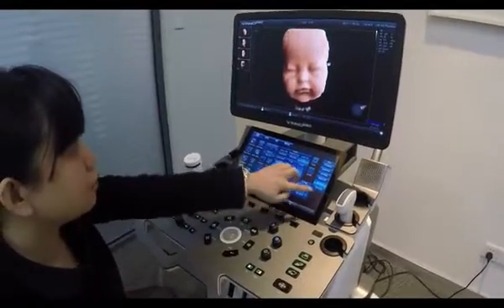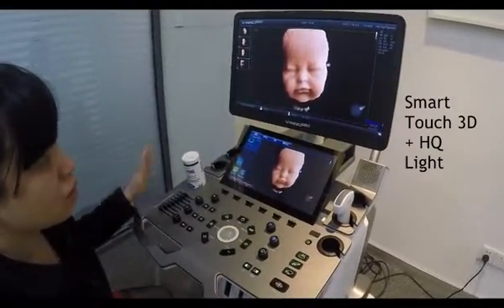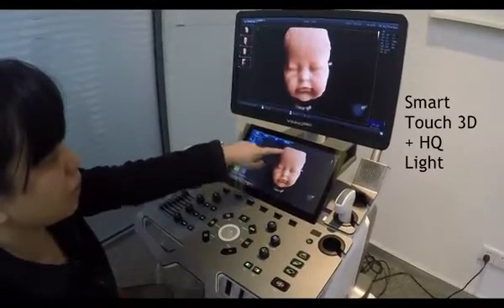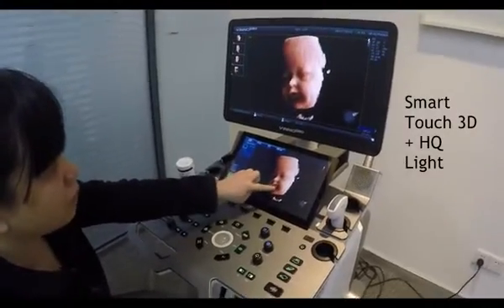Also, I can slide to the next page to enter the smart touch control panel. From here I can turn off the HQ light and then by using the finger, I can move the direction of the baby face.